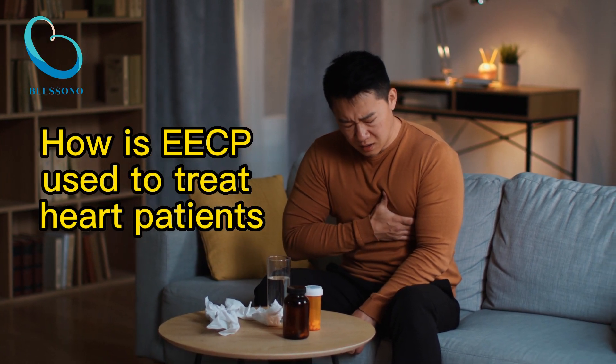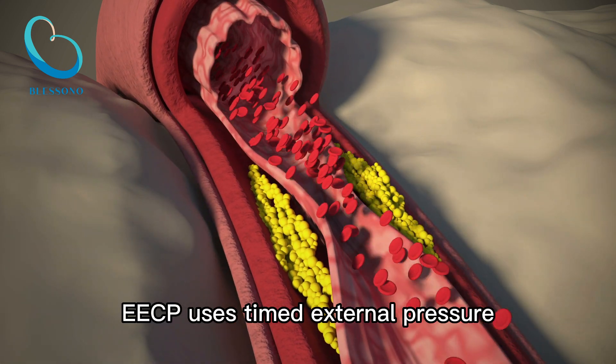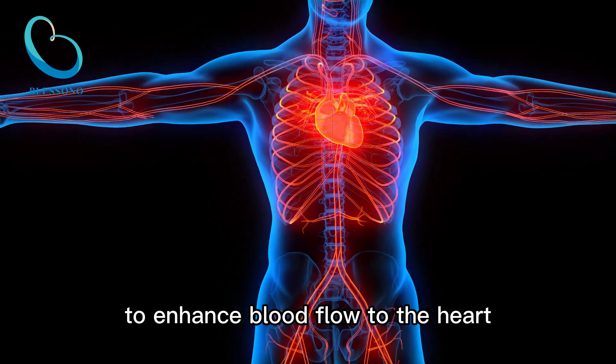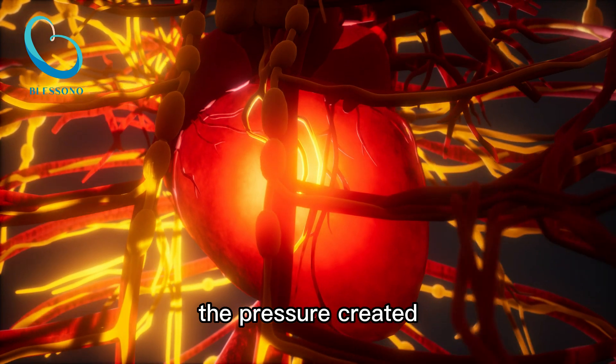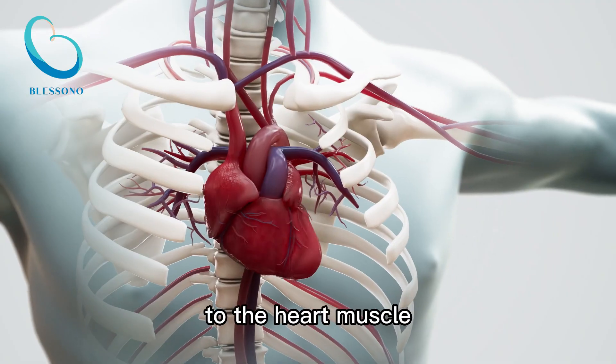How is EECP used to treat heart patients? Improved blood flow. EECP uses timed external pressure to the blood vessels in the lower extremities to enhance blood flow to the heart. As the cuffs inflate and deflate in sync with the patient's heartbeat, the pressure created helps push blood back toward the heart, increasing blood flow and oxygen supply to the heart muscle.